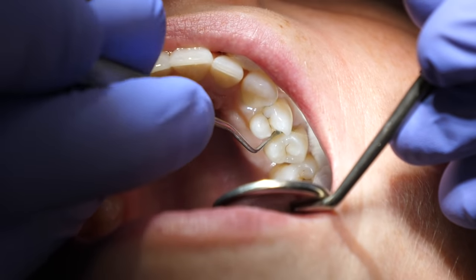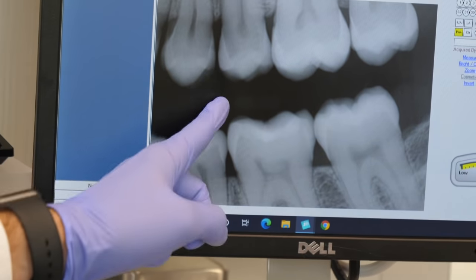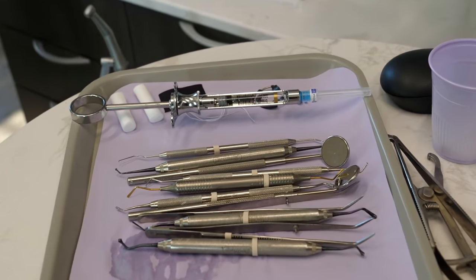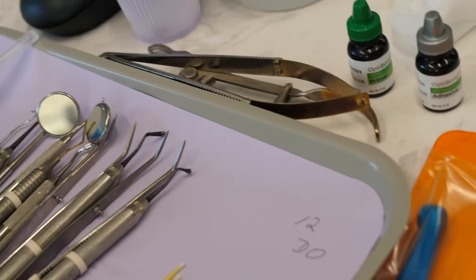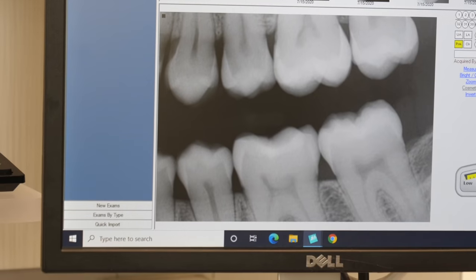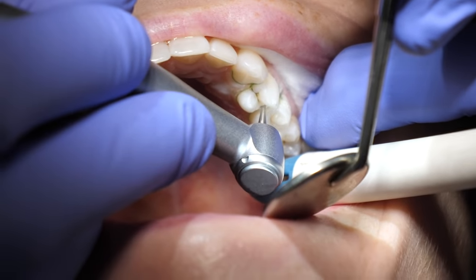In this video, we will watch a cavity filling at the dentist. The goal of this procedure, in particular for this patient, is to, of course, remove the cavity from the tooth, which happens to be in between the two teeth, and also contour the filling to make sure it's flossable so the patient will not get another cavity in this area.